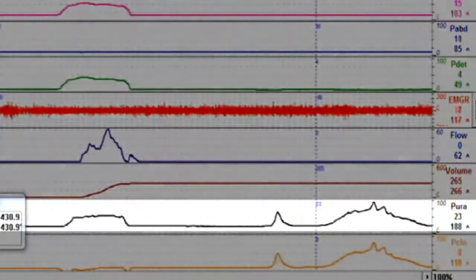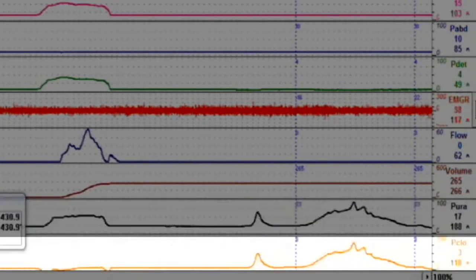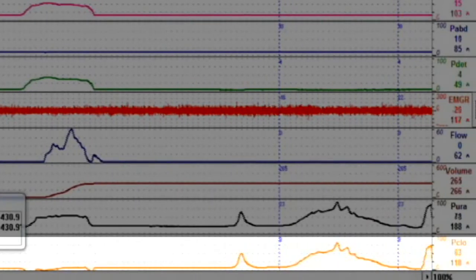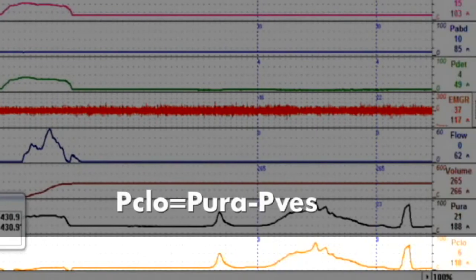The P-URA channel will measure the pressures from P3, or urethral pressures, while the P-CLO represents closure pressure, which is calculated by subtracting P-VESS from P-URA.